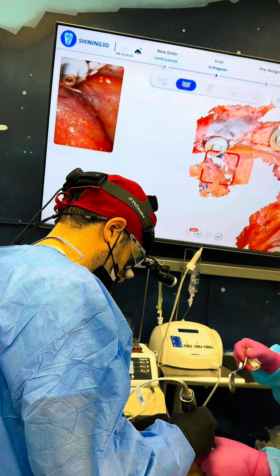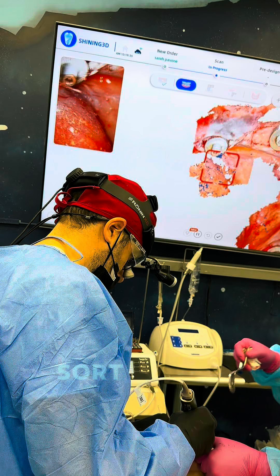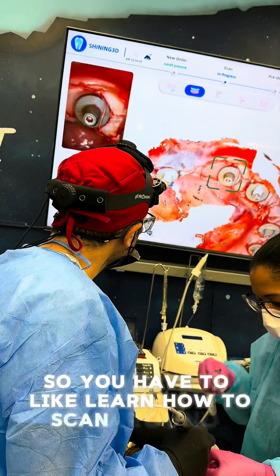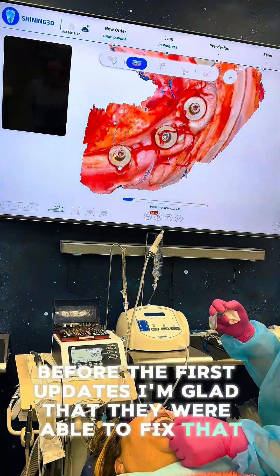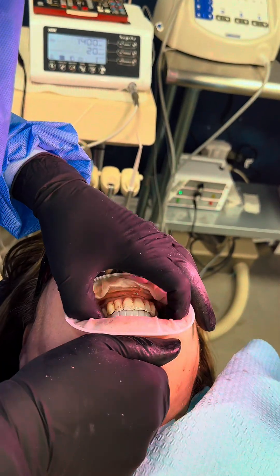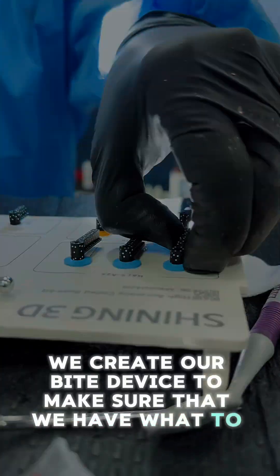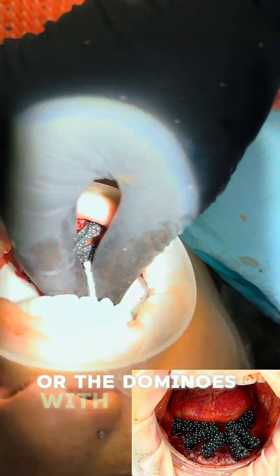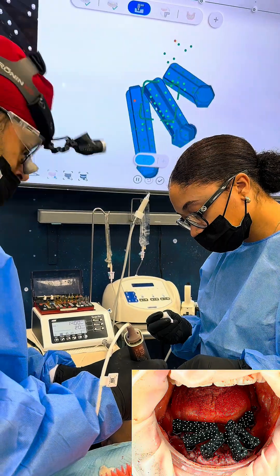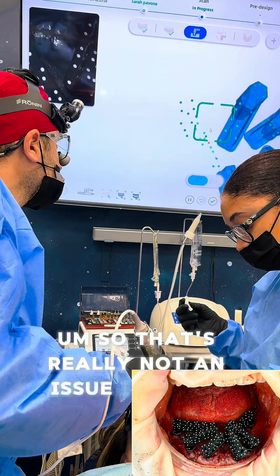One thing that's a little difficult with the Shining is that it's not one-to-one - when you hold the scanner in the mouth at a certain coordinate, it won't show that coordinate on screen immediately. It's sort of delayed, so you have to learn how to scan around it. But the soft tissue scan was way better than before the first update, which is great. Then we put in our bite device, trimmed it down, put the different scan flags in with different sizes, and it picks it up really fast and easy.